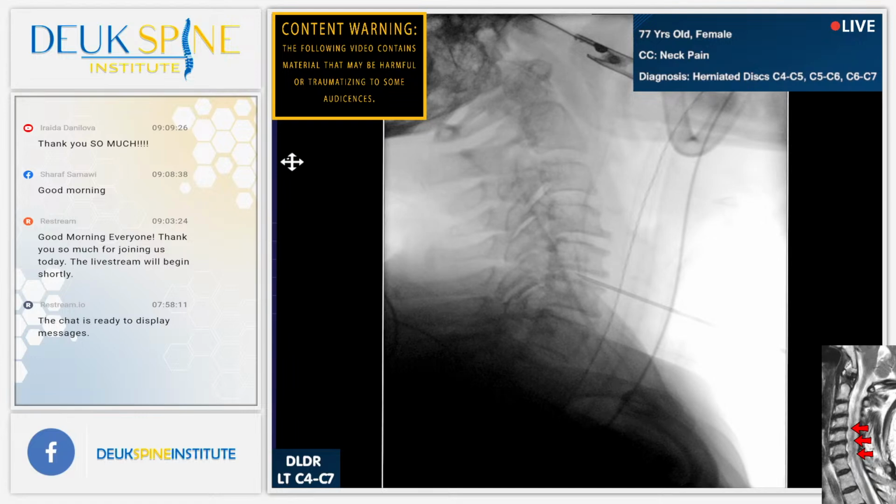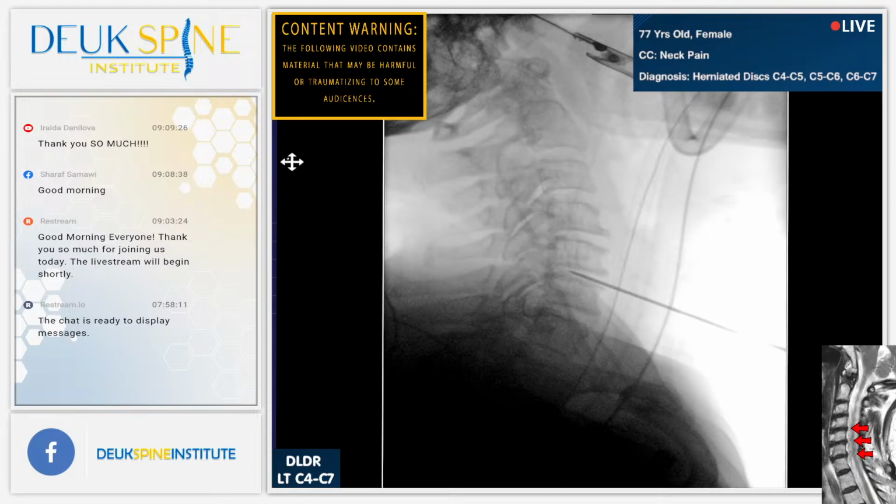All right, well, we've done what we can. It's a mostly degenerated disc. I don't know if you have that, Henry, by the way. It's more of a degenerative disc disease. Did you shorten this? Guide wire? No. Shot? Just looks shorter than normal. Shot? All right, so the guide wire is in place.